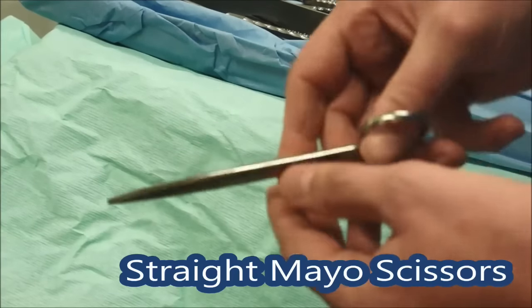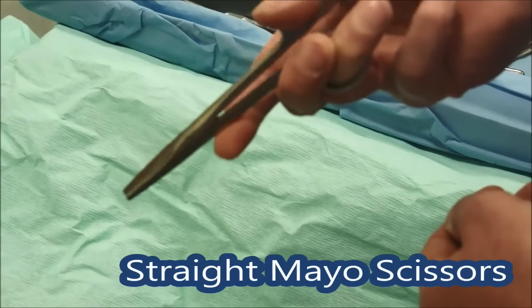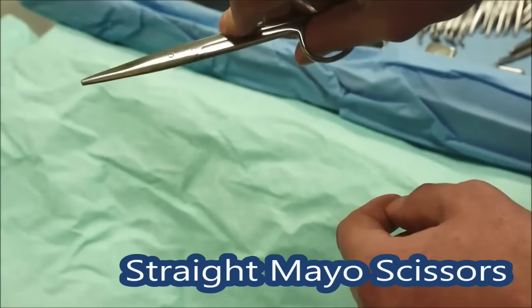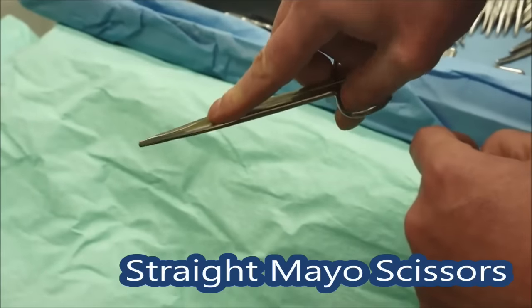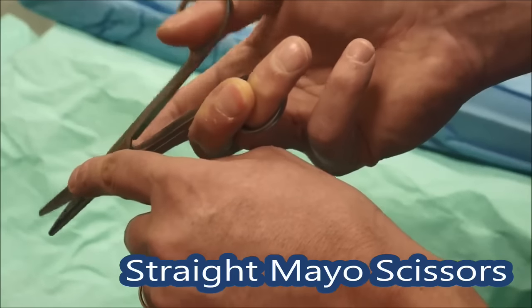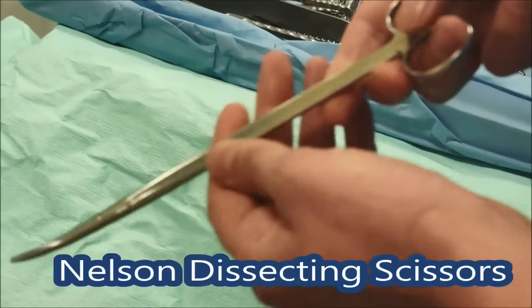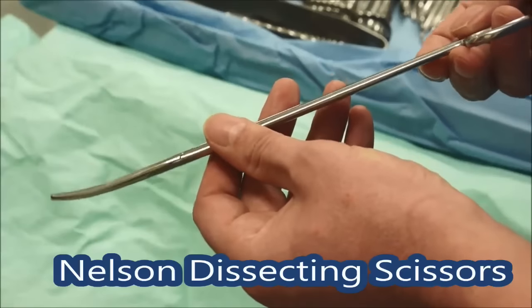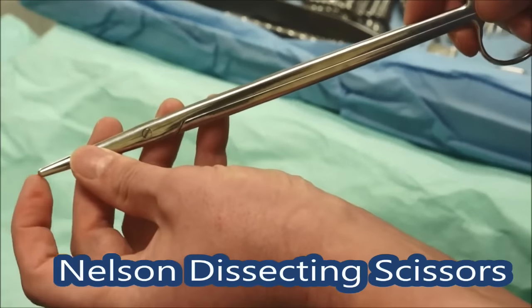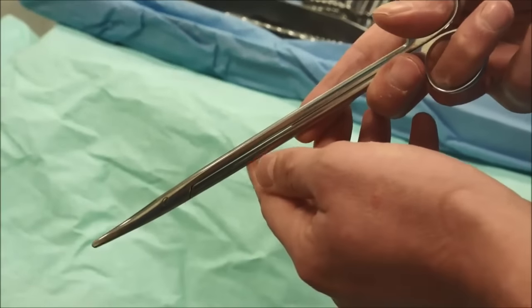These are the suture scissors — called straight Mayo scissors — and they're like your average scissor, very good for cutting sutures or anything else you need to cut, like a stone bag. Again put your finger on the pivot of the scissors and just cut, and use the tip. Get used to using the tip because if you're down a deep hole and you're using the far end you can easily cut well past what you intend and cut something you didn't mean to. These longer ones are called Nelson scissors — very much like the other scissors, with a long curved rounded end — and they do exactly the same job of dissecting and cutting tissue but they're longer for access down deeper cavities.